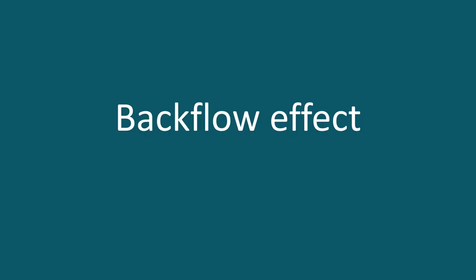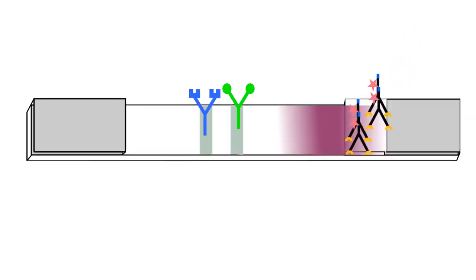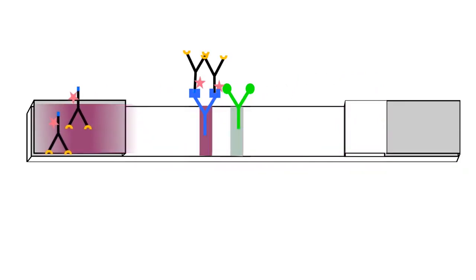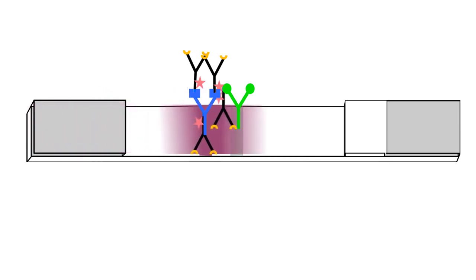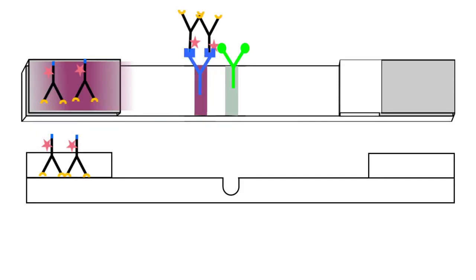How does the backflow effect work? Well, again, we will have a sample without any antigen, so no antigen will bind to the conjugate. Everything will migrate. The control line will turn purple, and the rest will continue to migrate. If now we wait for too long, the strip might dry out, and what will happen is that the antibodies might migrate backwards.